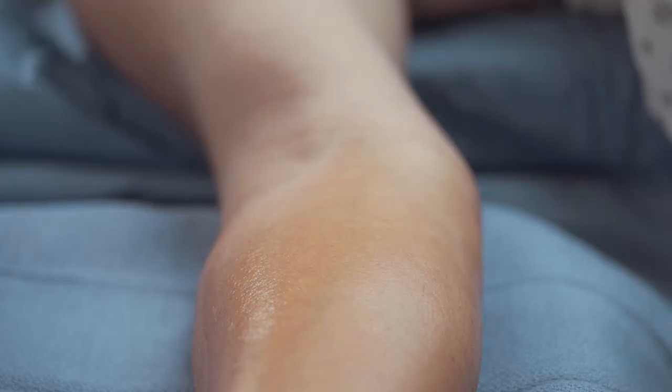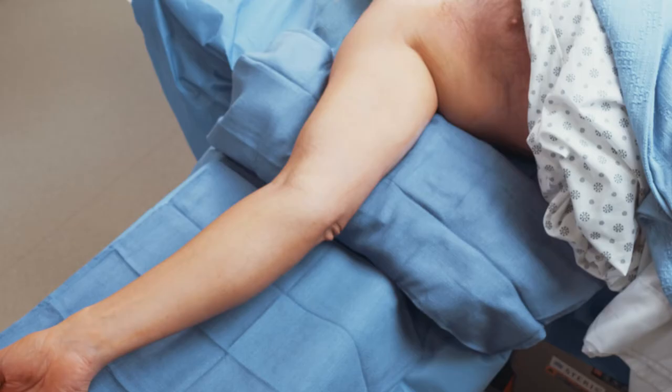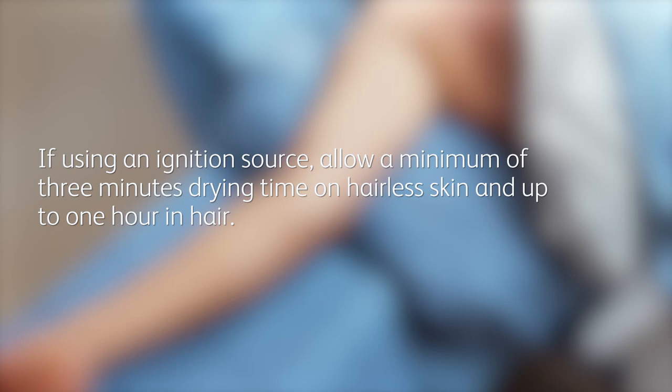As the solution dries, the sheen becomes less apparent and takes on a matte appearance. For optimal adhesion, make sure the area is completely dry before applying drapes or dressings and before using an ignition source such as a cautery or laser. Drying requires a minimum of three minutes on hairless skin and up to one hour in hair. Your site is now prepped and ready.